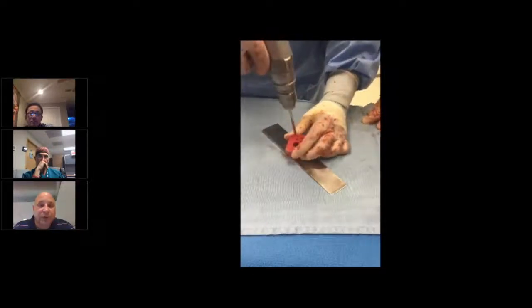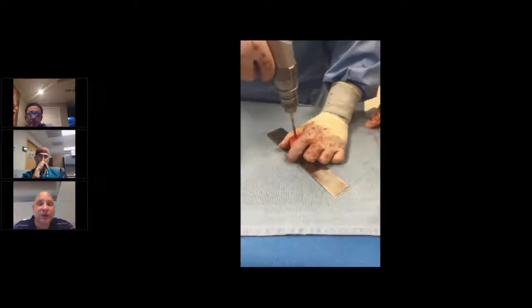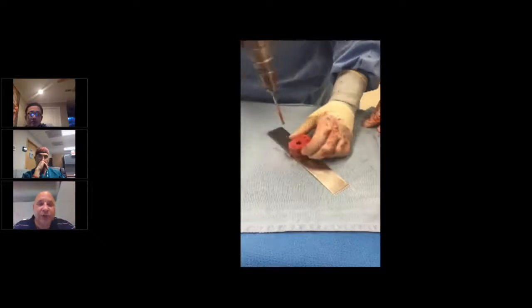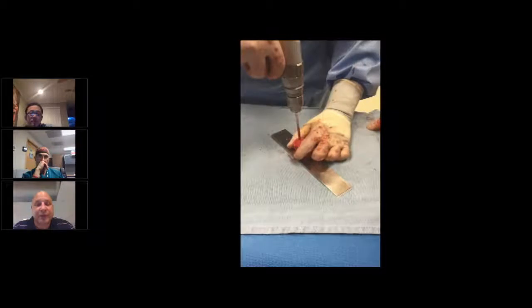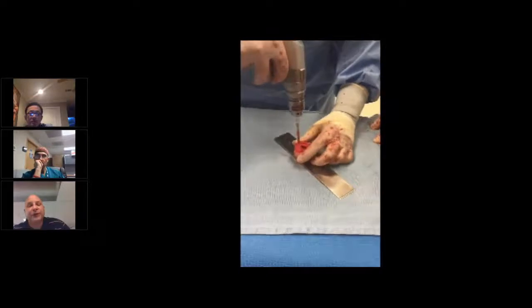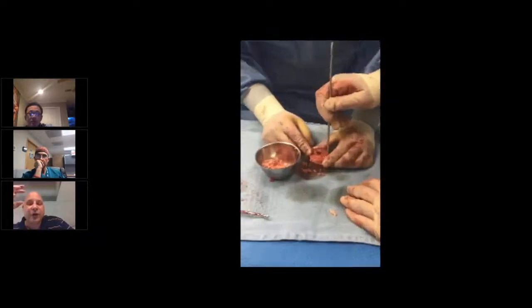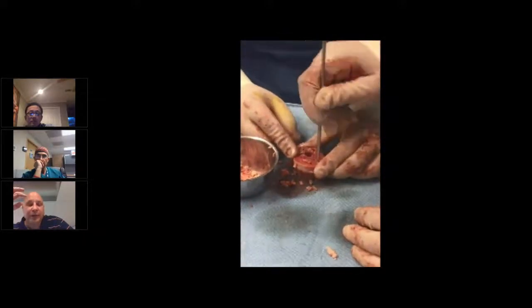And once we drill all the holes, then what we do is we take the fibula and we will morselize it inside of a bone grinding machine, a bone mill. And we grind it several times to make the particulate matter very small, and then what we do is pack that into each of these holes completely so that we have a combination of allogenic bone and autologous bone all compressed and put together.